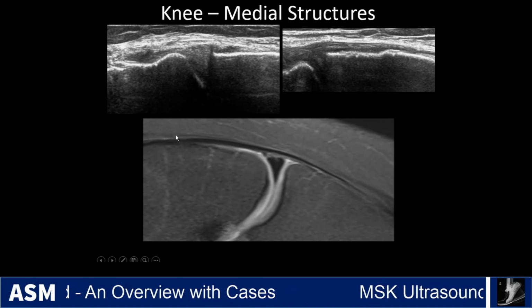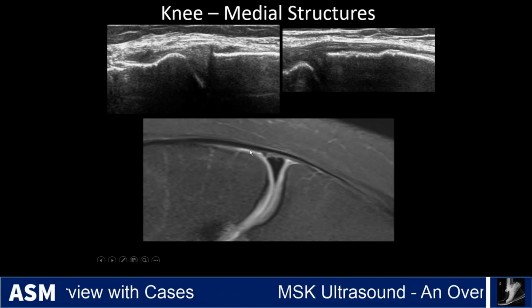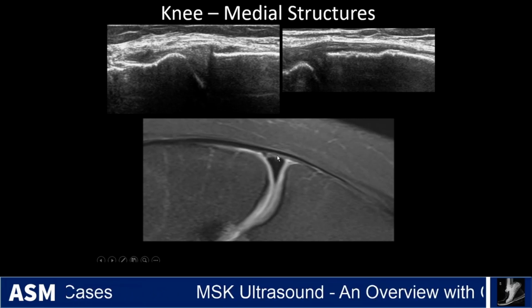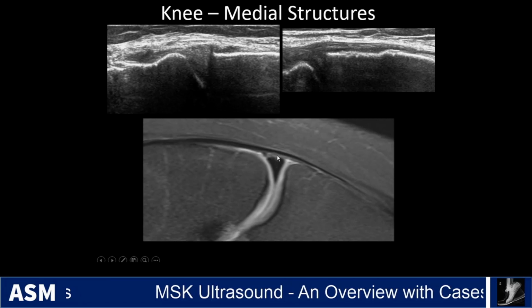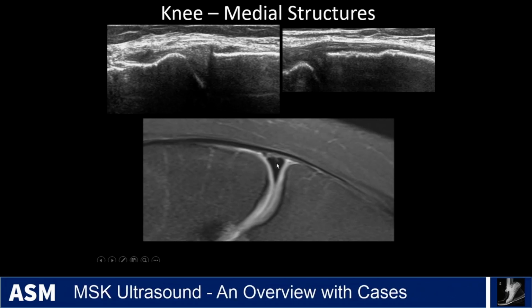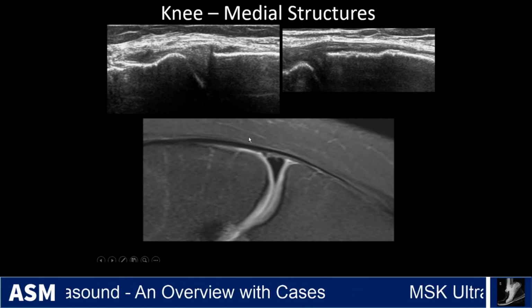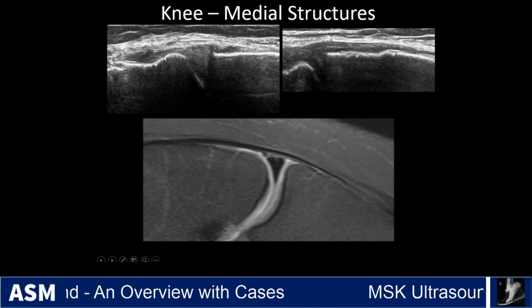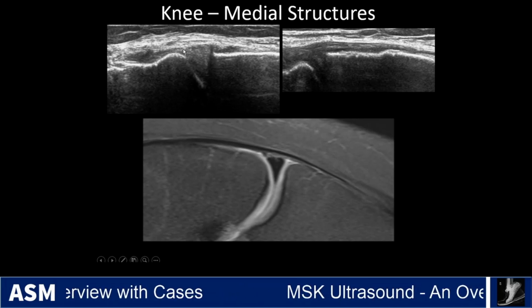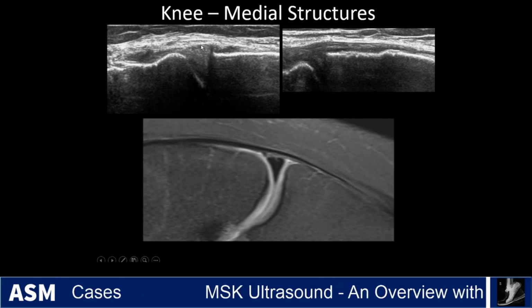Coming medially here, you see the superficial MCL coming down here, this hypo-intense line with the body of the medial meniscus here, and you can sometimes see the actual vasculature coming into the peripheral red zone here, and that's usually represented by a line coming in from a non-articular side of the red zone of the meniscus. And here you have the femur and the tibia, and you can see the medial meniscus here, this peripheral third. This should be hyperechoic when there's not anisotropy.